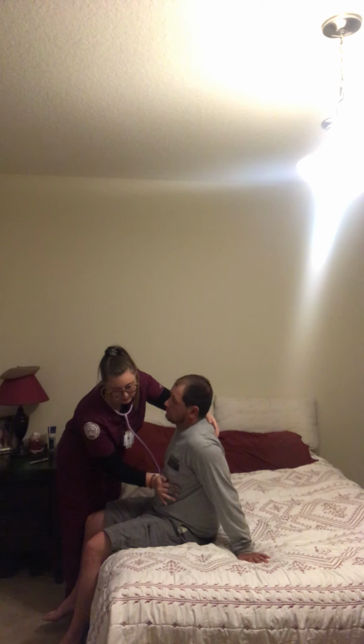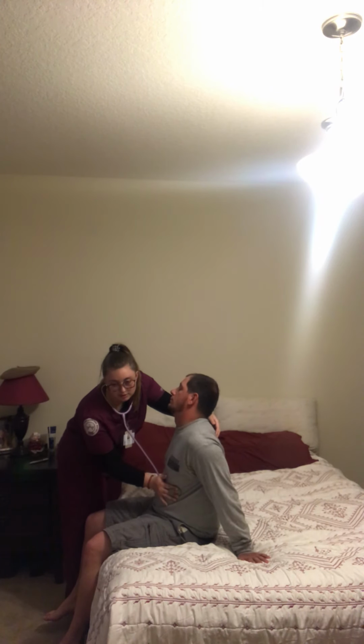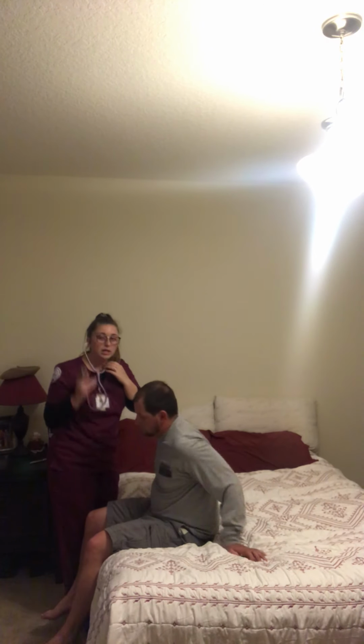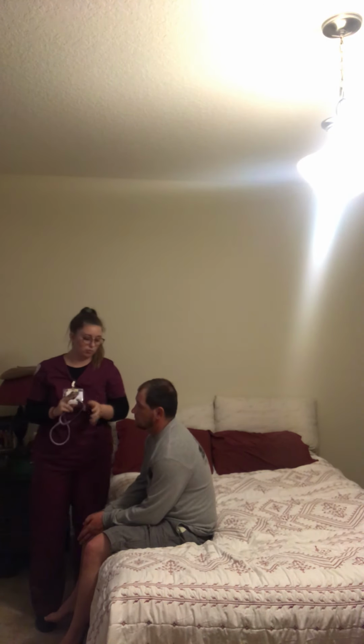And now I'm going down to the apex, which is the mitral valve, in the fifth intercostal space of the midclavicular line. This is also the PMI, point of maximum impulse. I would listen here for 1 minute. Okay? Sounds are normal, rate and rhythm is normal, no increased effort of breathing. The sounds are normal, just the regular lub-dub is what I hear.